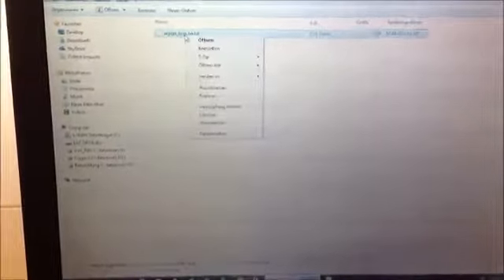In this case, the file ending is not displayed. In my German Windows version, I can enable the file ending like this. And now you see we have the .txt twice. In this situation, LiquoGuard will not be able to download data. The txt is a part of the file ending. It should not be a part of the file name. Therefore, you should not see double, only once.